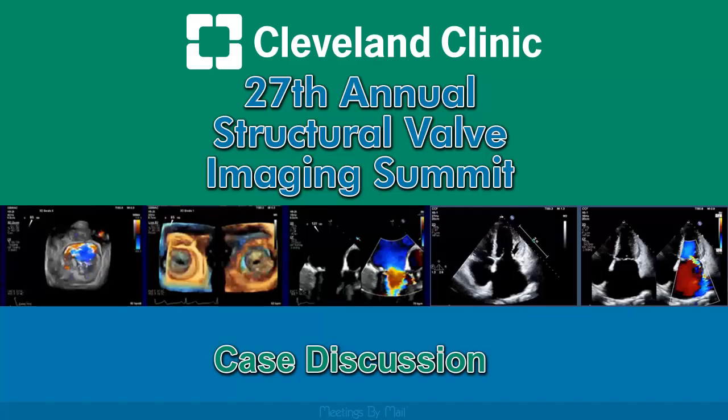It's an unusual case. If I had to do it, I would probably plug it first, because once I put a clip there, I'm very careful not to touch the clip and not manipulate close to the clip. I'm just concerned about that. And I'm poking, because you have to poke many times with a wire to be able to cross. The rate limiting step to plug a hole is just to cross it with a wire, and then you have to force a catheter through it so you can advance the device and then bring it back. And sometimes it takes a stiff wire. Sometimes you have to pull the catheter back, and then you have to try something, and then you have to improvise along the procedure. And having a clip there would really make me very, very nervous.